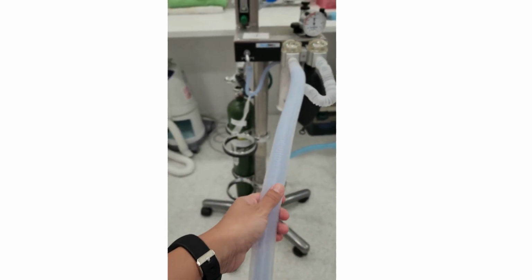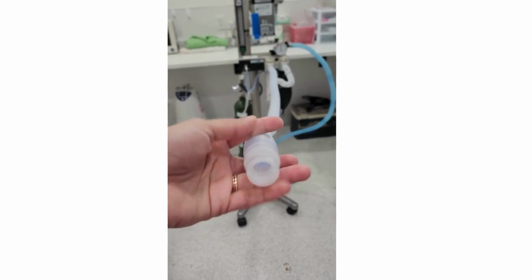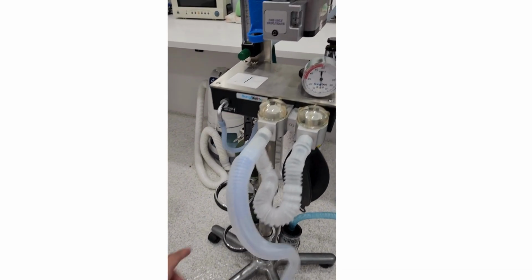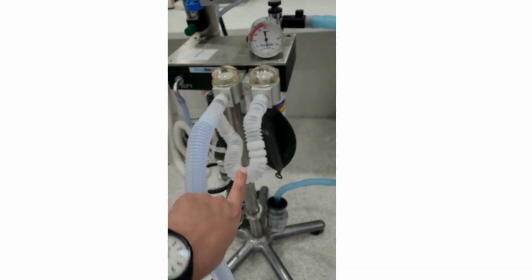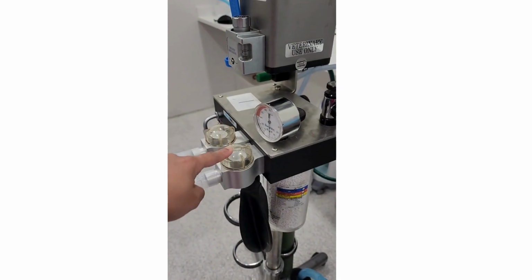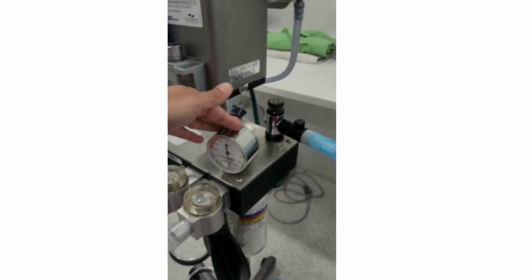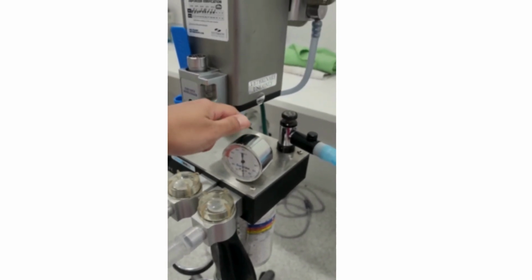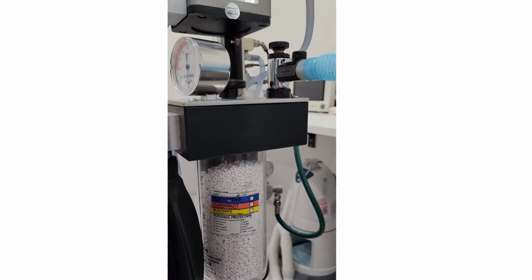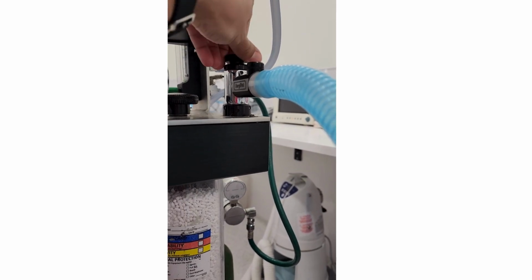This specific machine has a Bain system that is basically a tube within a tube. The inhale gas will run in the inner tube, while the warm exhale gas will run in the outer tube, acting as a passive temperature regulation device. Then the exhale gas from the patient is going to go to the exhalation hose and then to the exhalation valve. This machine has a manometer that will help you monitor the pressure within the system, and it shouldn't go above 20 centimeters of water.